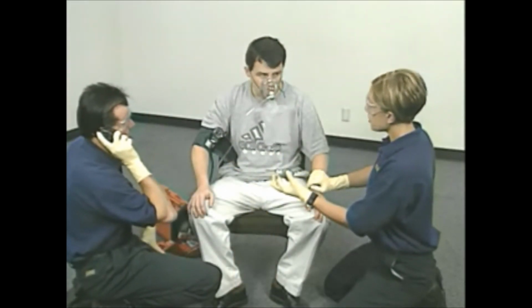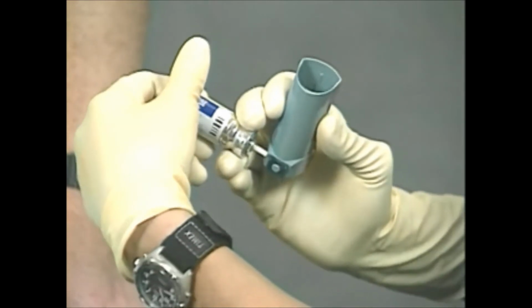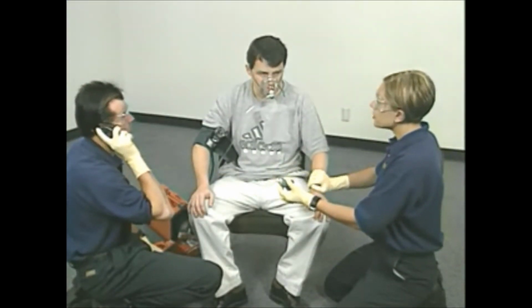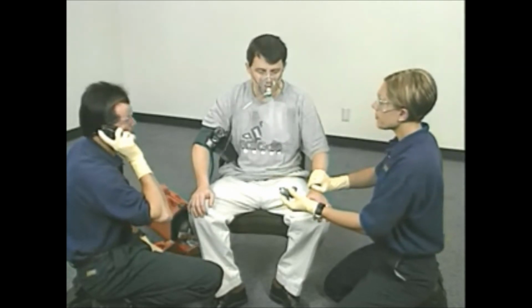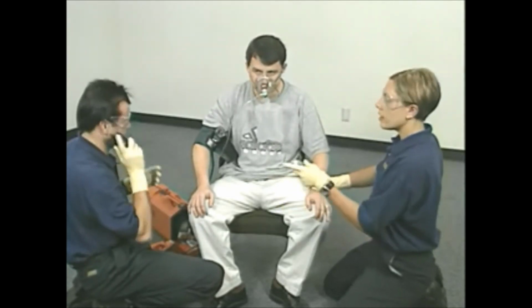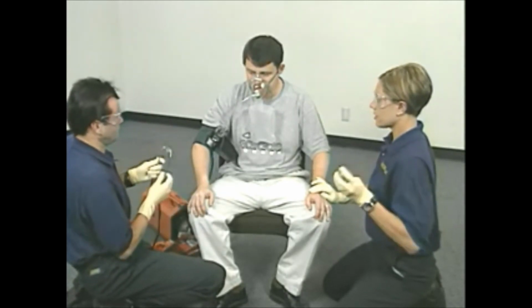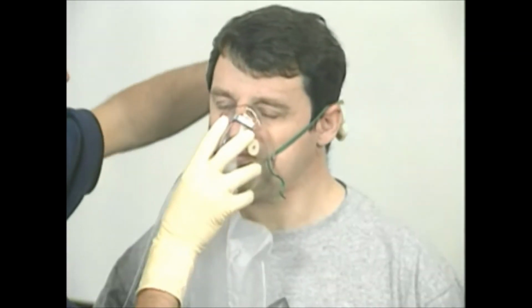Now let's take a closer look at performing this skill and some problems you might encounter. Take BSI precautions. Assure that you have the right patient, the right medication, the right dose, and the right route. Explain the procedure to the patient and get his or her consent for an assist if needed. Shake the canister vigorously for at least 30 seconds. If the patient is wearing a mask, remove it.